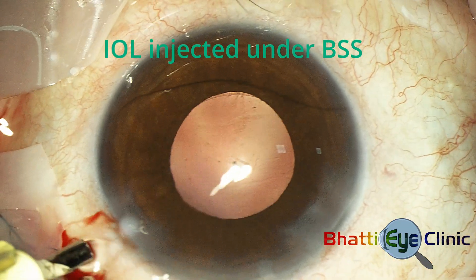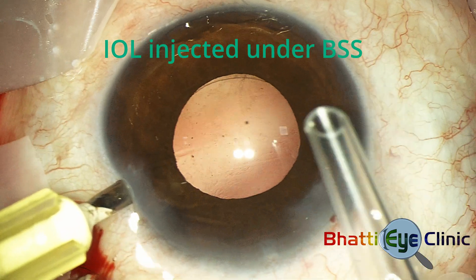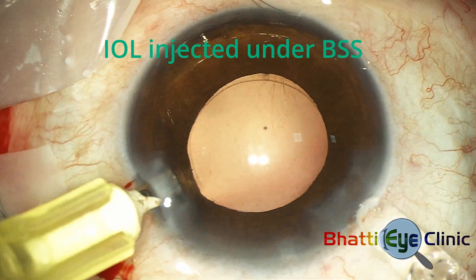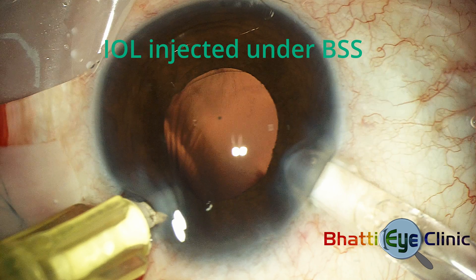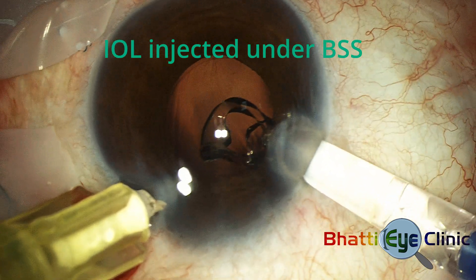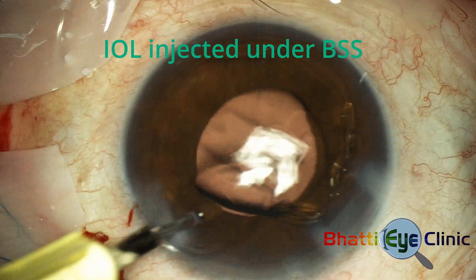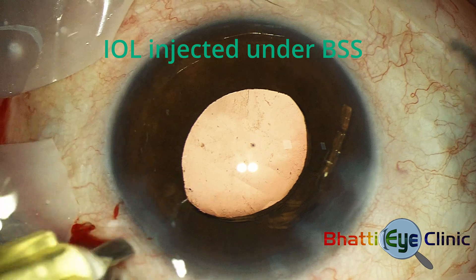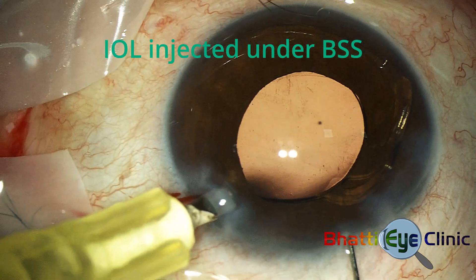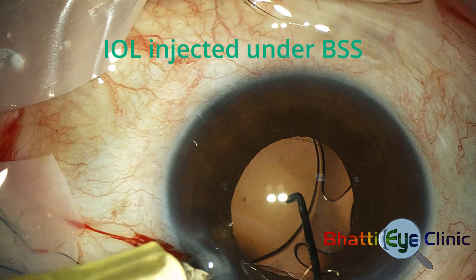A temporary anterior chamber maintainer made from a 20-gauge needle is held in the left hand and used to infuse fluid into the anterior chamber while the IOL is injected into the anterior chamber with the right hand. No viscoelastic is used and the injector is primed with BSS, in this case with some ofloxacin added. Once the IOL has been unfolded and dropped into the anterior chamber with its inferior loop in the capsular bag, the superior loop is then flexed into the capsular bag using a dialer. The surgery is now effectively over.